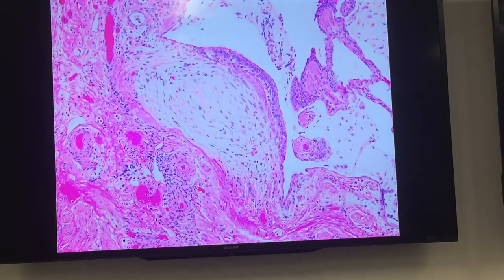So Iman says this is a fibroblast focus. Does it have inflammatory cells in it, Iman? No. Is it branching in shape or dome shaped? Dome shaped. Airspace or interstitial? Interstitial. Does it have a kind of serpiginous configuration? No. Is there a bronchovascular bundle nearby that you can see at this point? This is a bronchial lining. That's fair. This is bronchial lining cell. That's good.